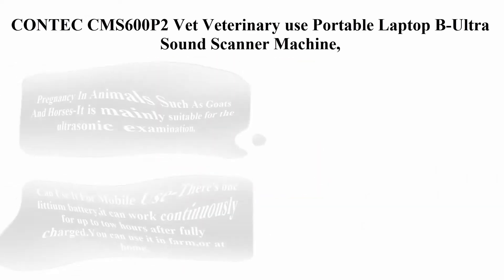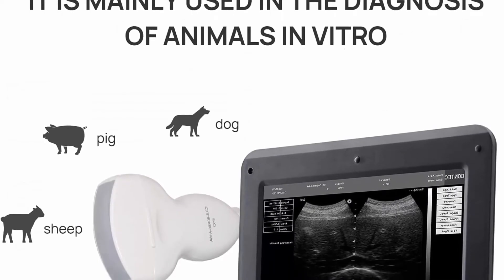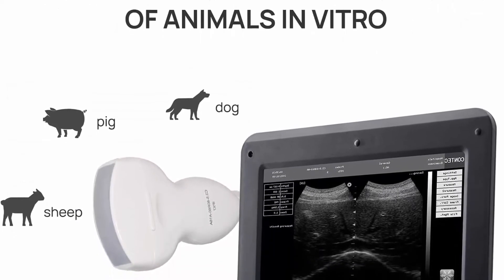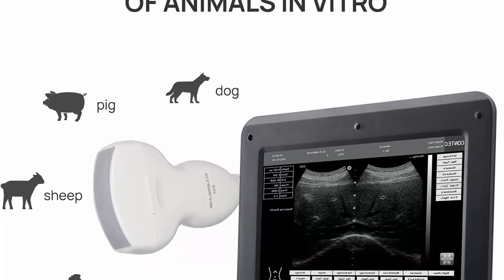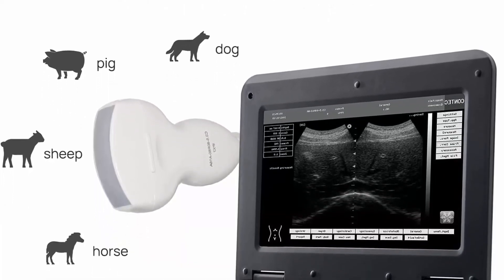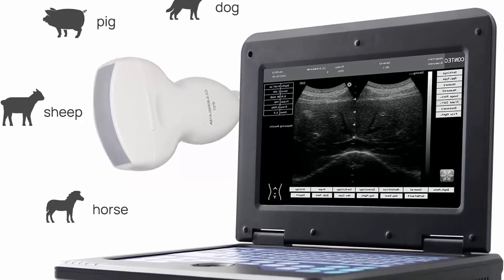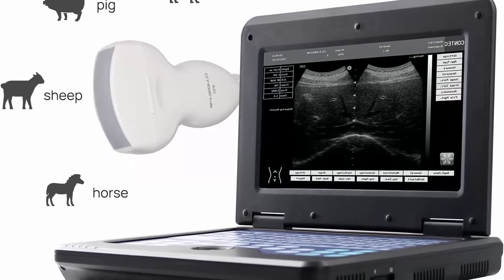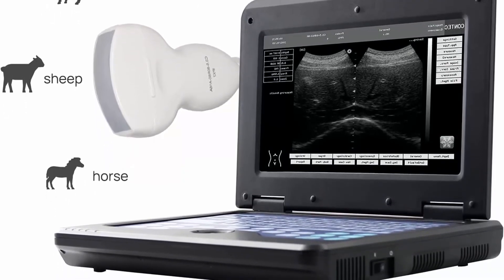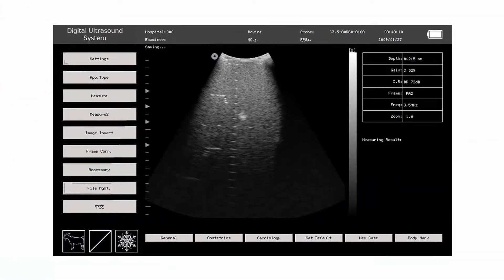Number 4: CONTEC CMS600P2 Vet Veterinary Use Portable Laptop B Ultrasound Scanner Machine for horse, equine, cow, and sheep use. It is mainly suitable for the ultrasonic examination of goats, horses, dogs, pigs, cows, ponies, and mares. It comes with a 3.5 MHz convex abdominal probe with high resolution and high quality.